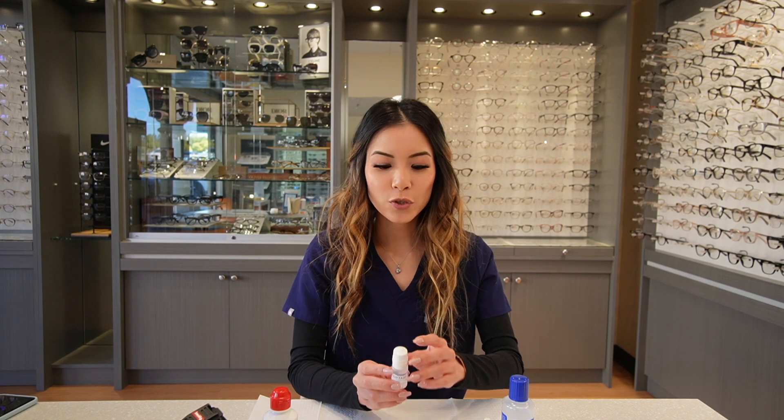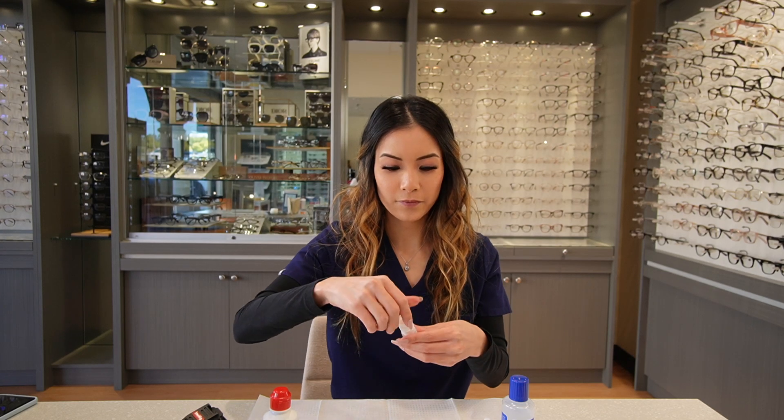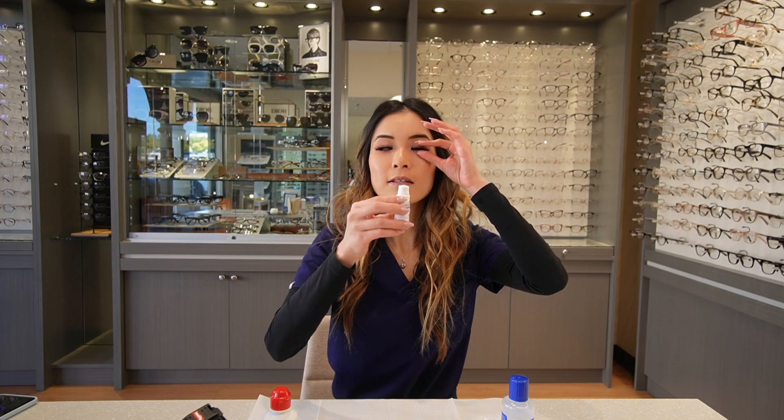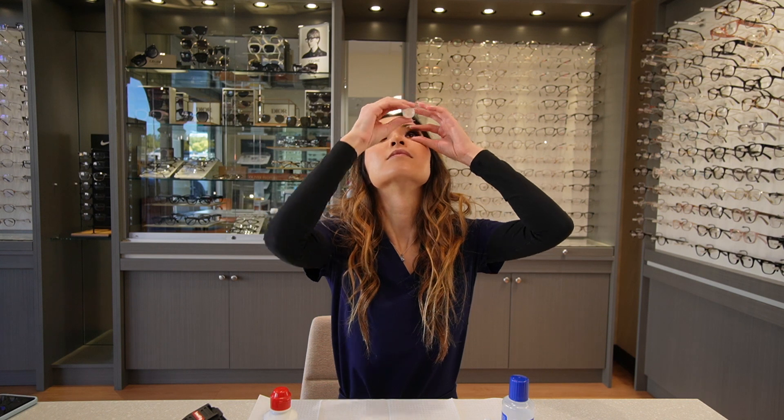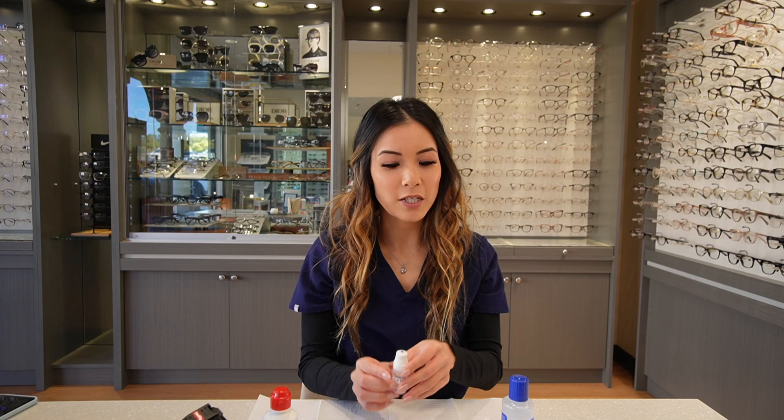After, you would use your artificial tear to place one drop in each eye. We'll go ahead and wait five minutes, and after that, we'll place another drop in each eye.